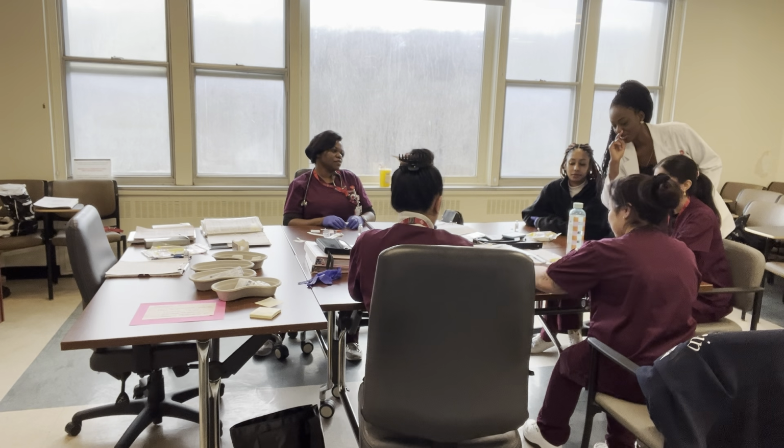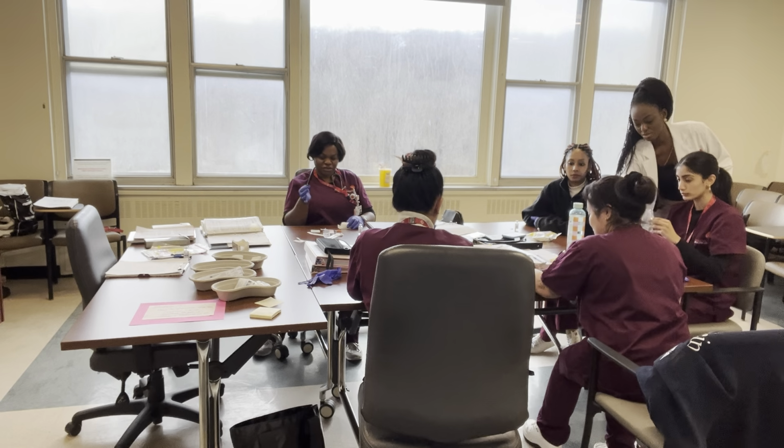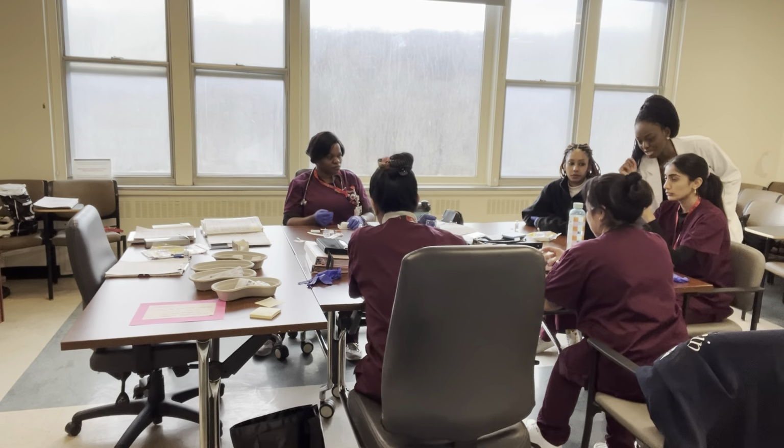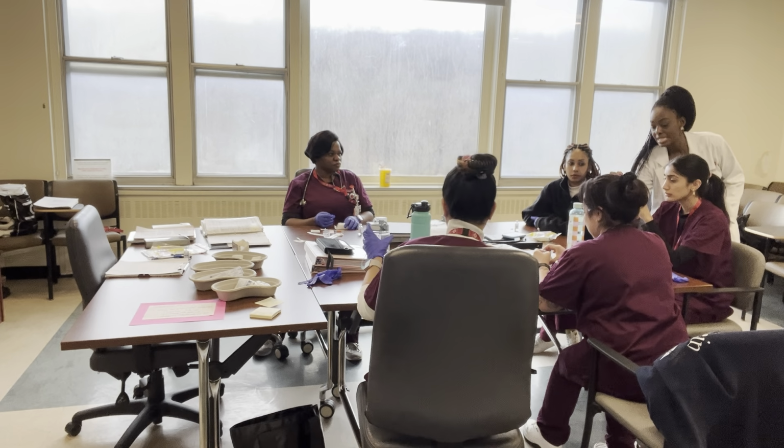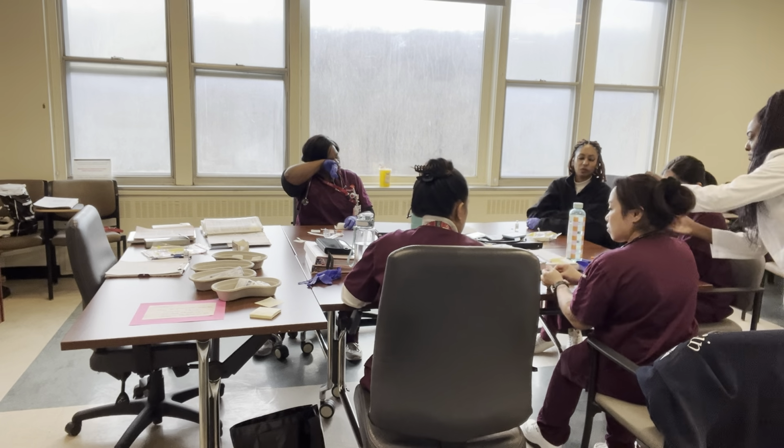Date on your vial to see when we open it. On the vial, because you open it next to it, put it directly on, and then the expiration. Like put the pen here? Yeah, anywhere on it, as long as we can visibly see it, and then how much. Let me just borrow it from you.